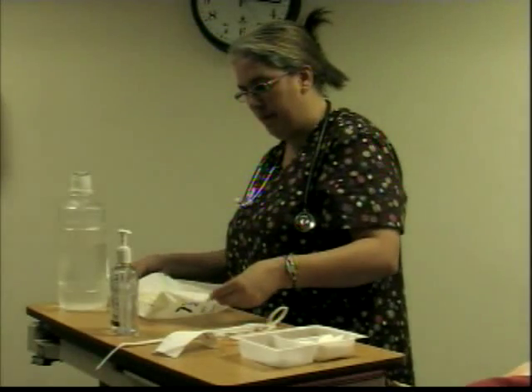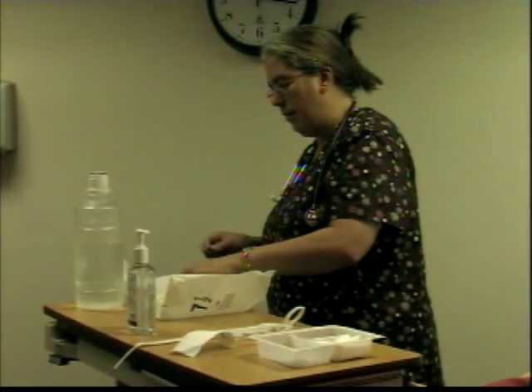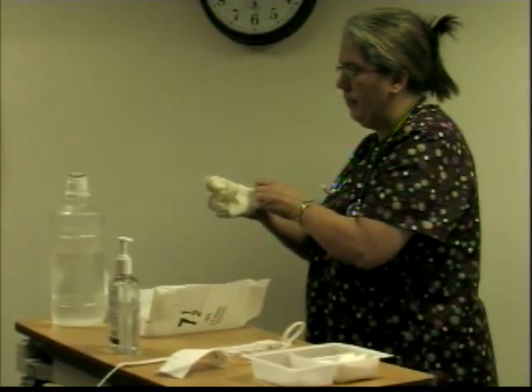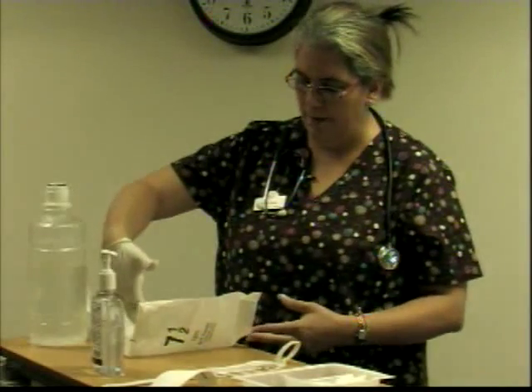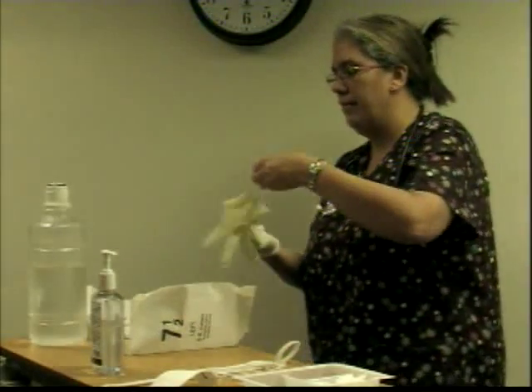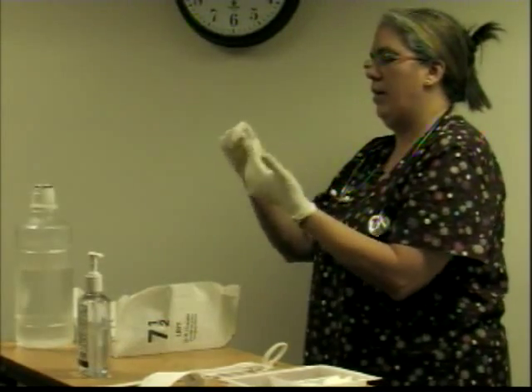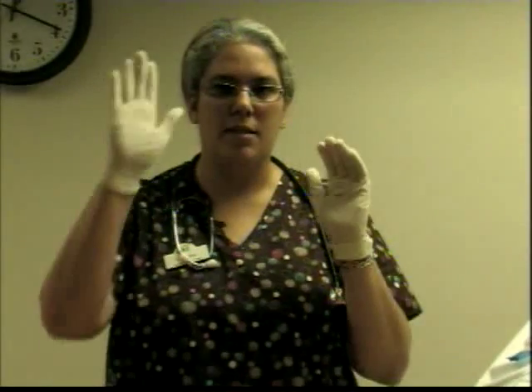Okay, make sure that this is kind of open in here. Get my first glove, step back and put it on. And I got kind of cut, so I'll make sure that I have my thumb hitchhiking, and I'm just using my fingers underneath it. And now I can go ahead and fix it. So now I have my gloves on. I have it above my waist. This is my non-dominant hand. This is my dominant hand.